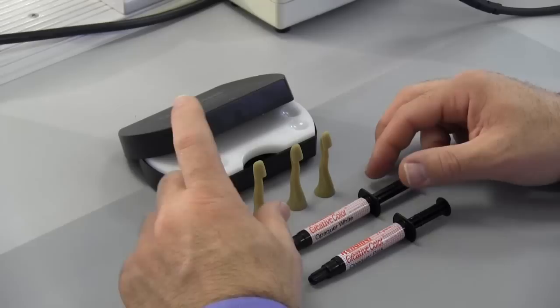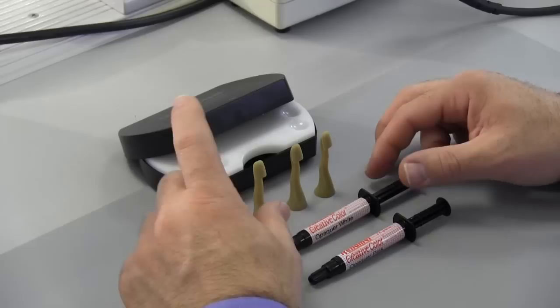In this exercise, we're going to show you the value of pink opaque over white opaque — not just by talking about it, but visually showing you how each one works and what it does for you in your office.